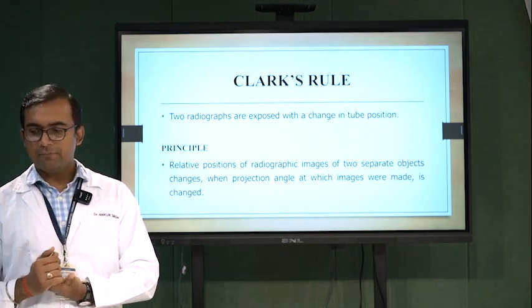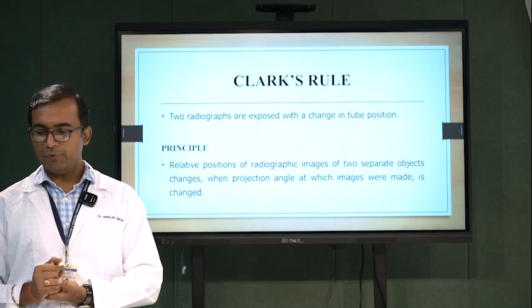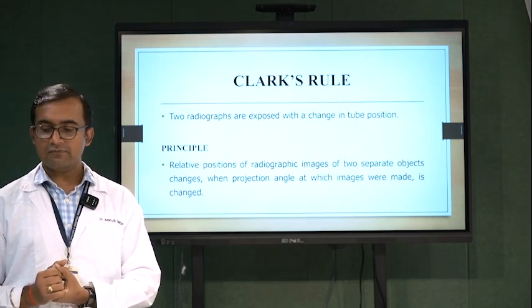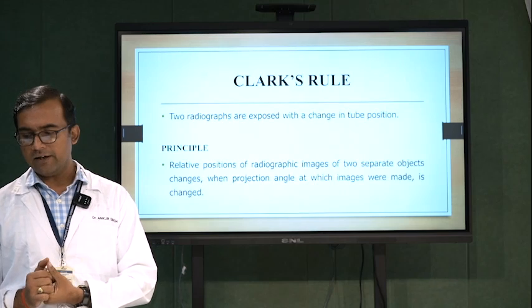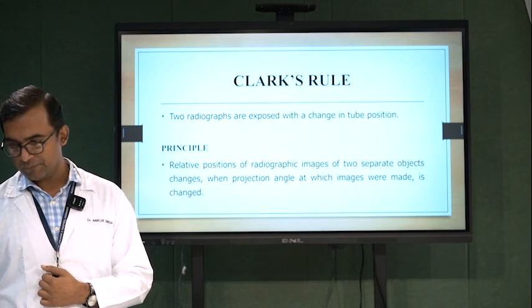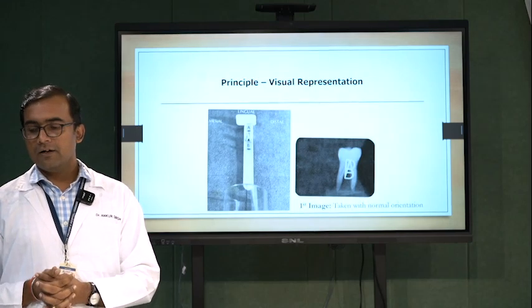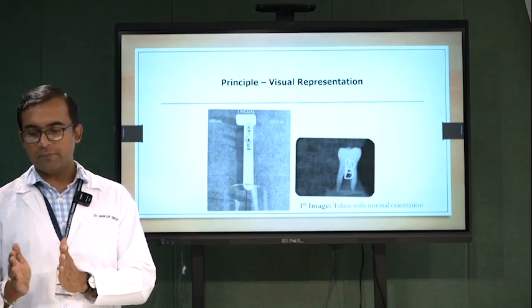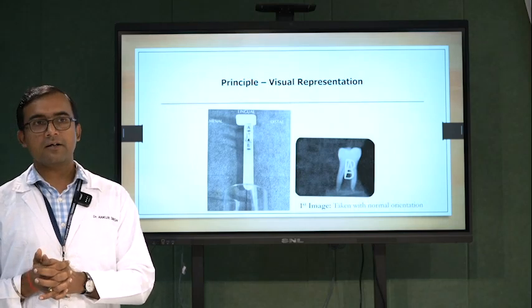The principle says that the relative position of the images of two separate objects changes when the projection angle at which the images were made is changed. Graphically, the principle can be explained as follows.